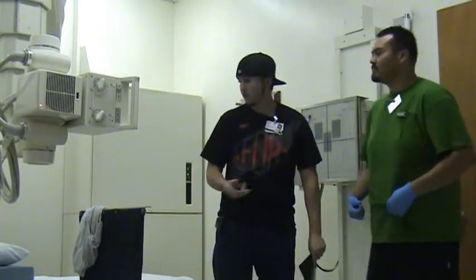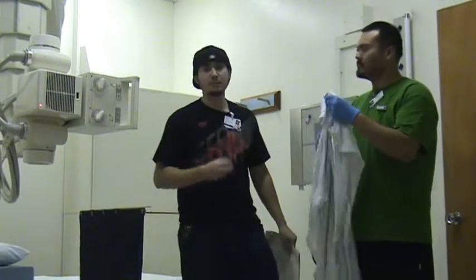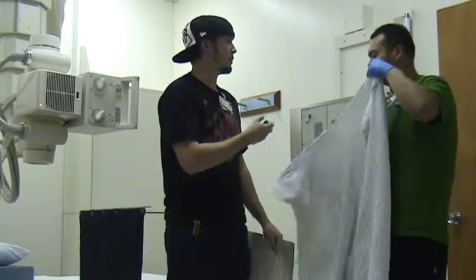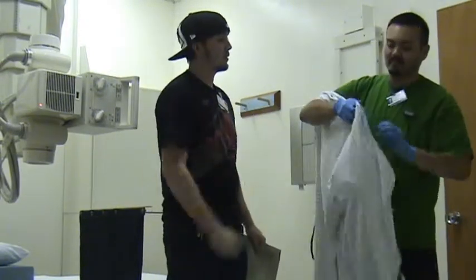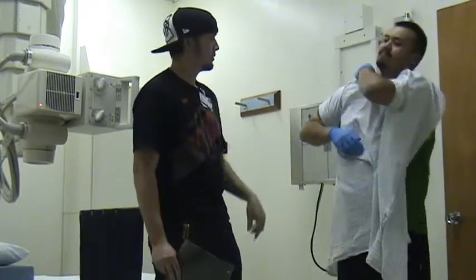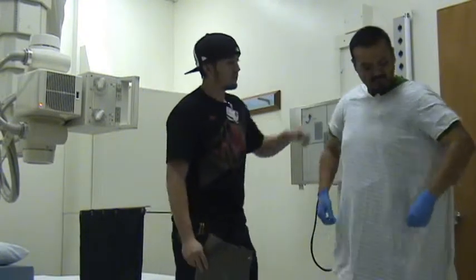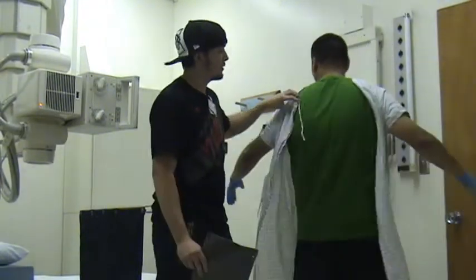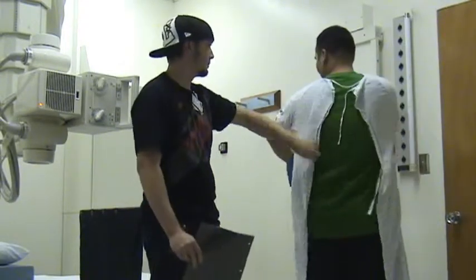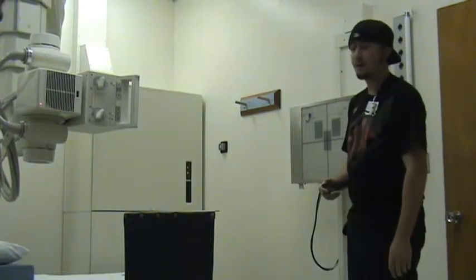We want to put a patient gown on them and let them know that if there are any necklaces or rings obstructing the chest area, they need to remove them. Then they put the gown on with the back open, just like that. Go ahead and give a little turn around there. So see, it's open in the back, and if they need help, you can help them tie the top and bottom. Okay, so now we're going to bring the patient to the bucky area.